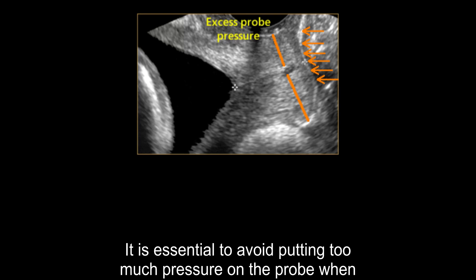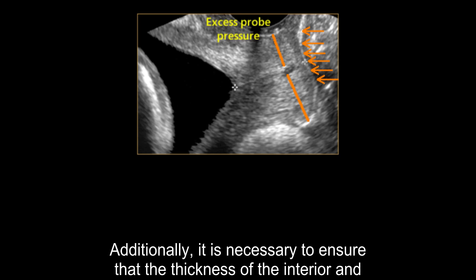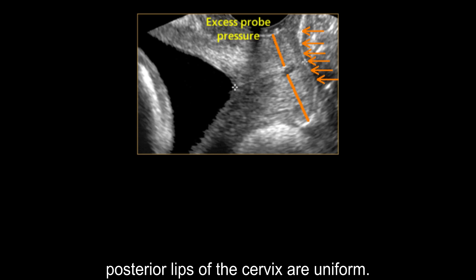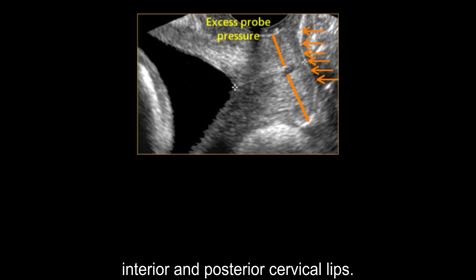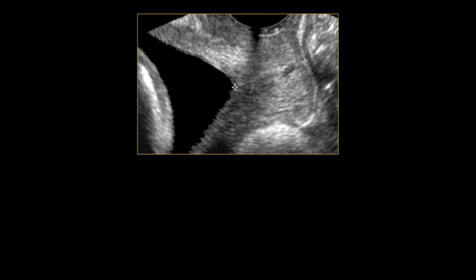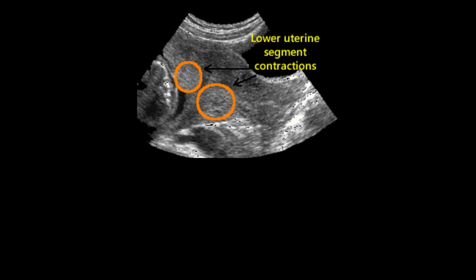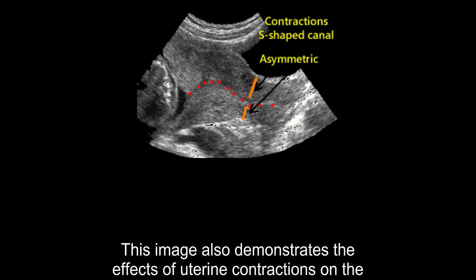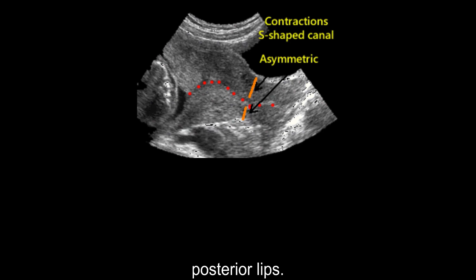It is essential to avoid putting too much pressure on the probe when examining the cervix. It is also necessary to ensure that the thickness of the anterior and posterior lips of the cervix is uniform. This image shows a noticeable difference in the thickness of the anterior and posterior cervical lips. The circular areas outlined indicate contractions in the lower uterine segment. This image also demonstrates the effects of uterine contractions on the cervix, which has an S-shaped canal and asymmetry between its anterior and posterior lips.